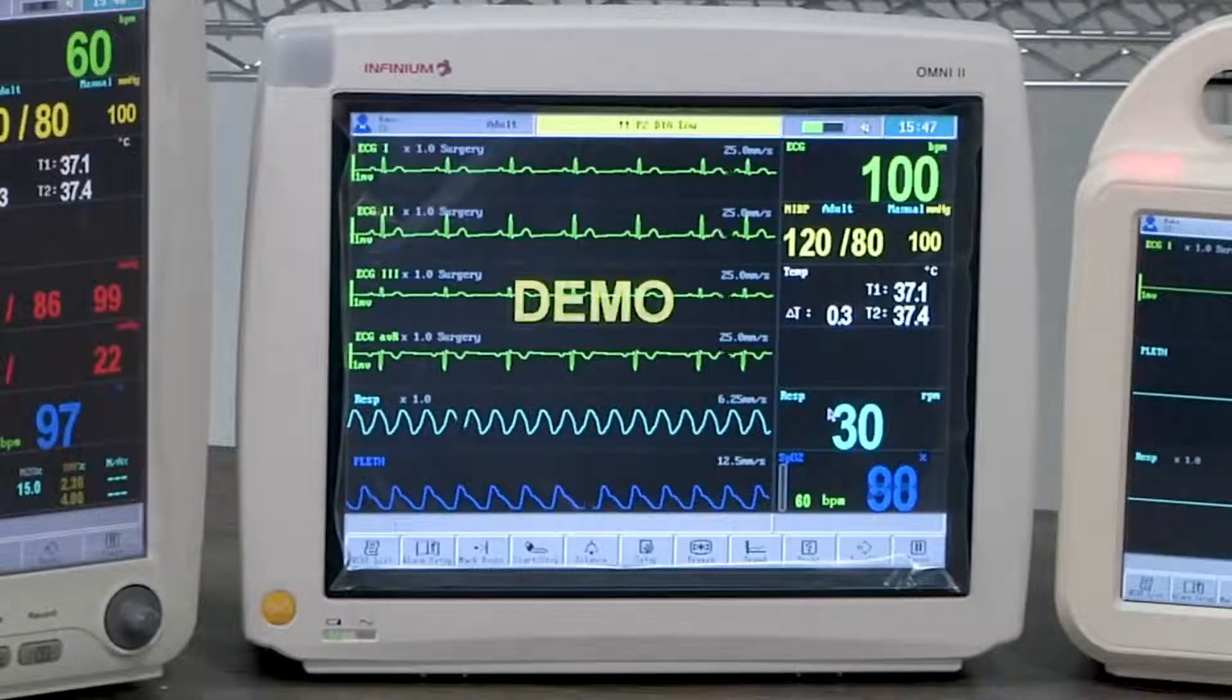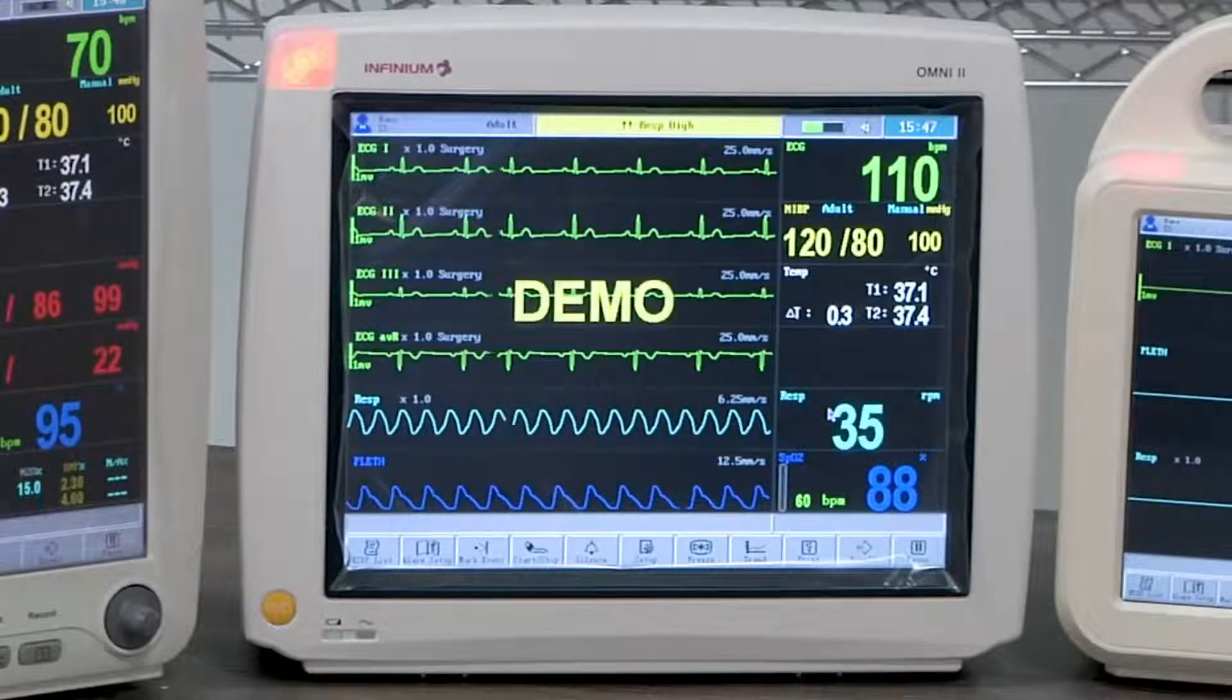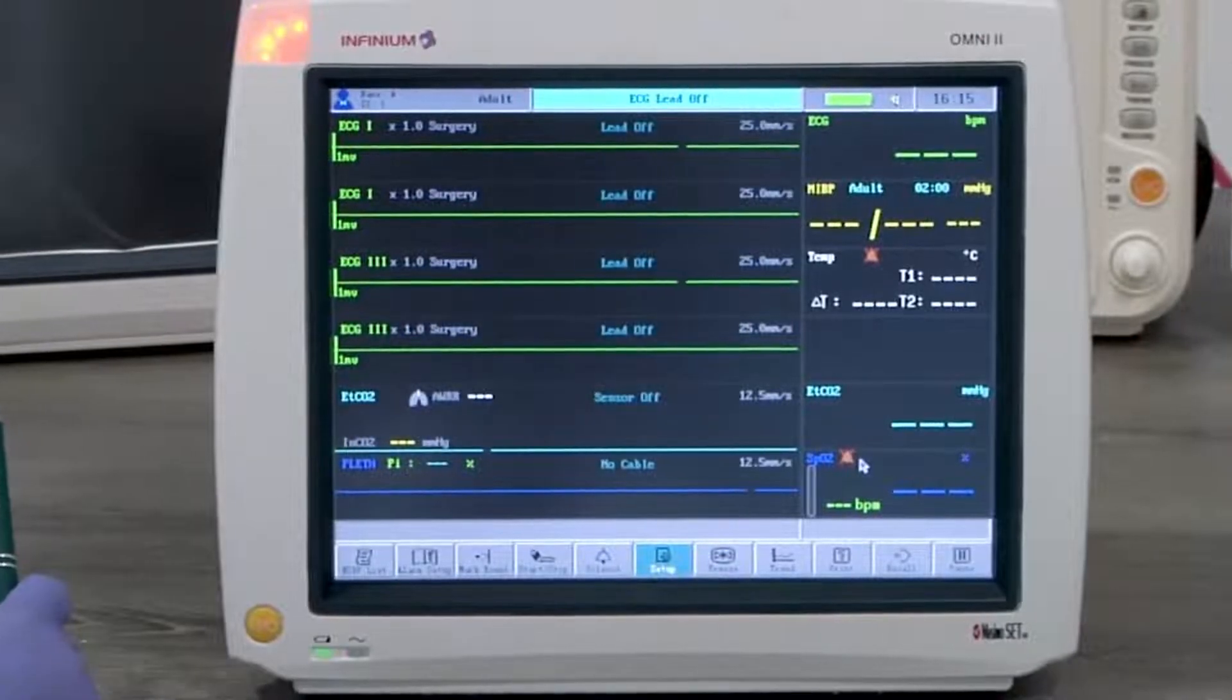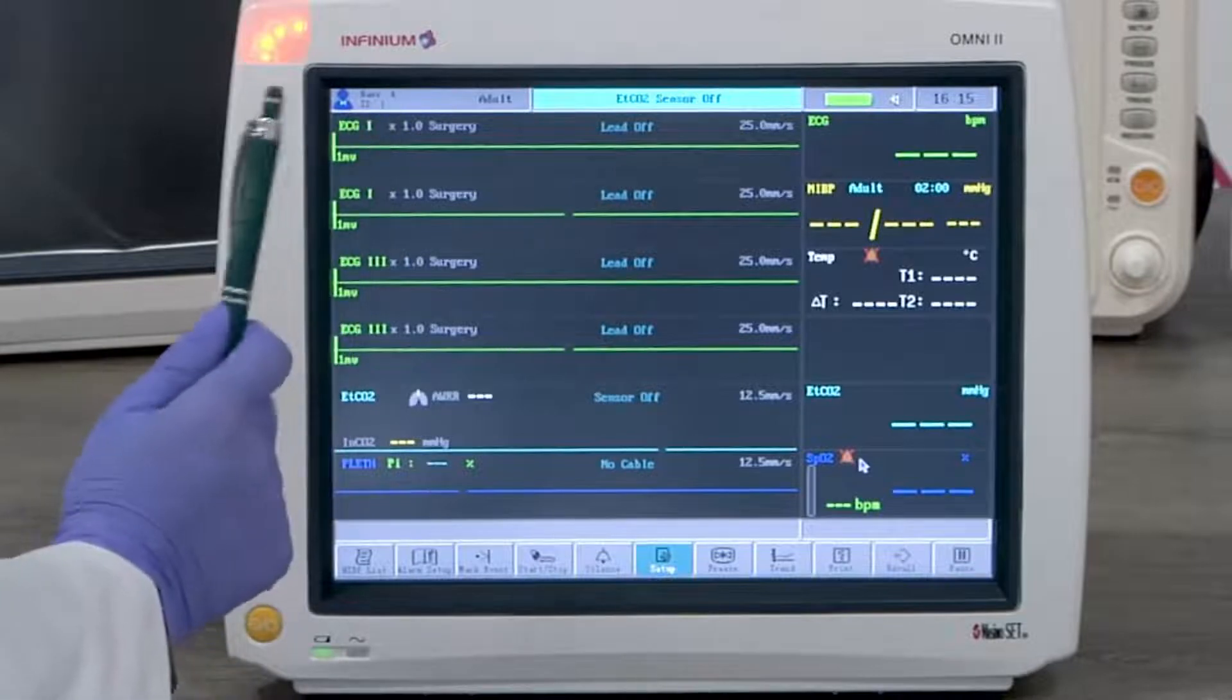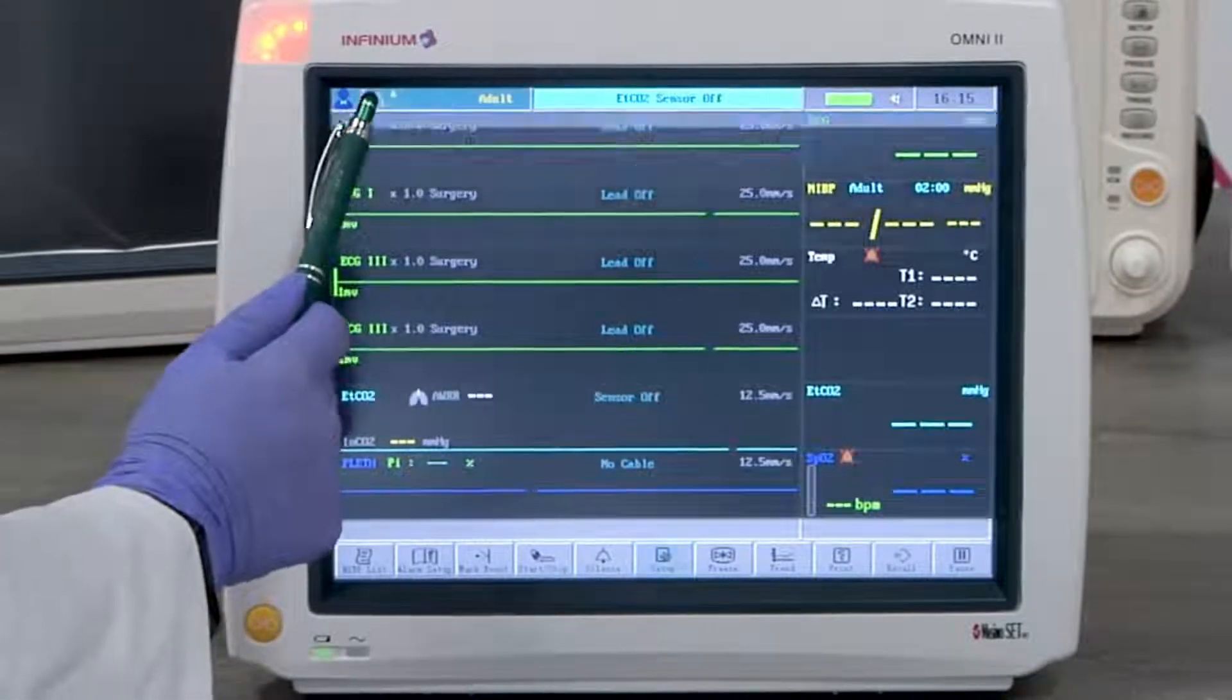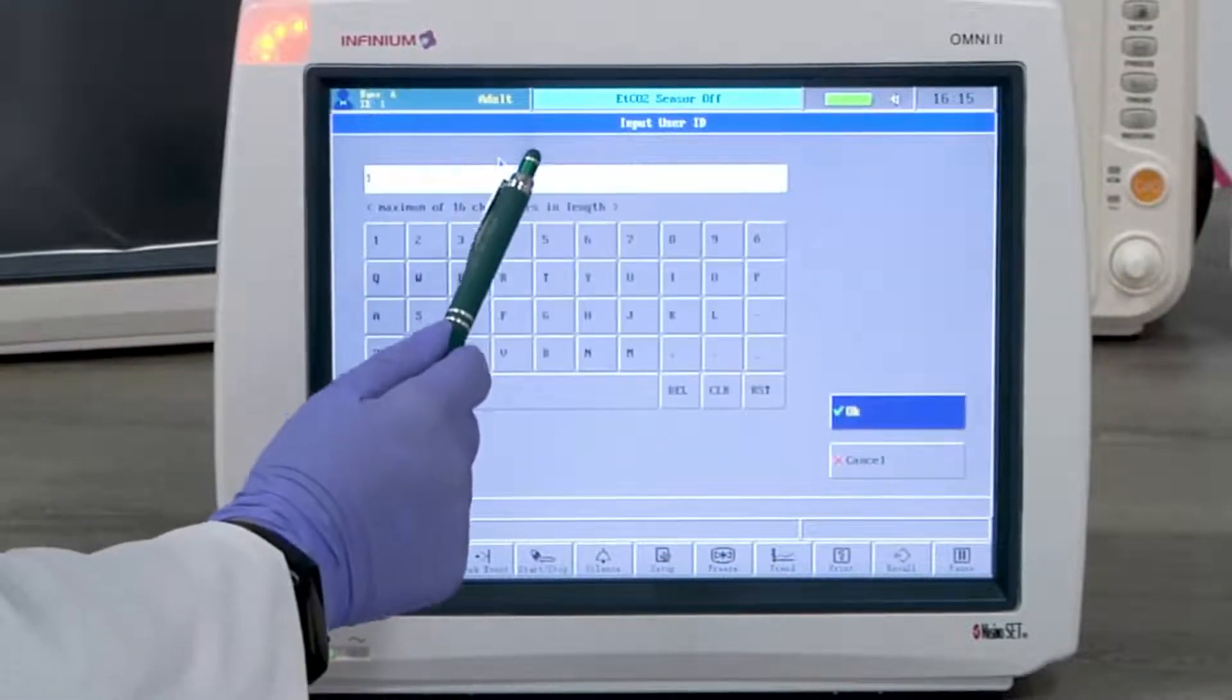This demonstrates how to use the Infinium Patient Monitor Omni 2. First, let's go over the general settings. Patient ID is required for the monitor to store patient data. By tapping on the top left corner, you will enter the patient info setup menu.